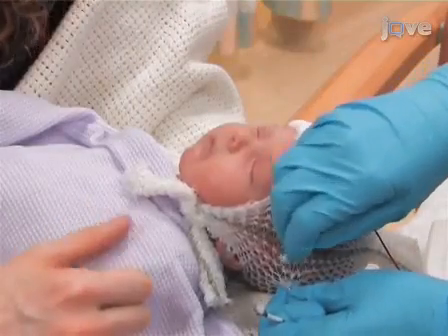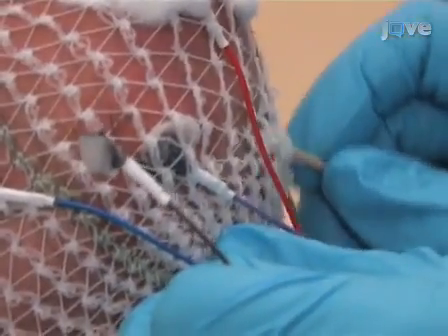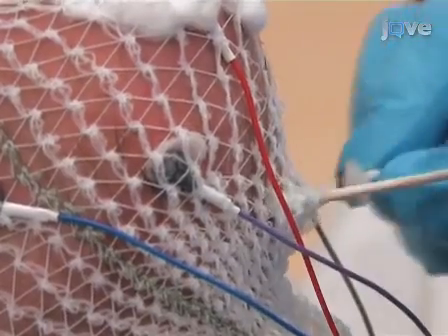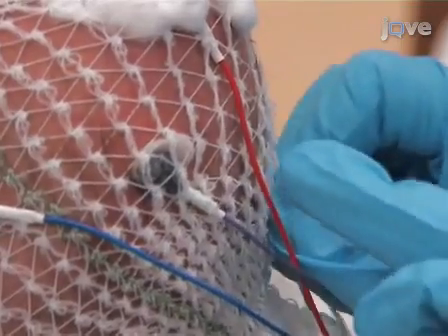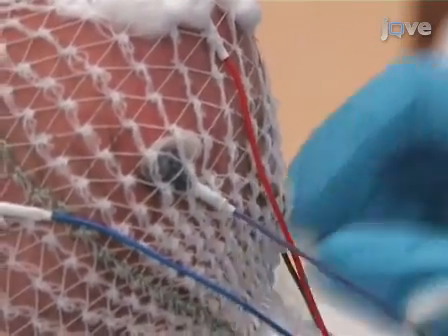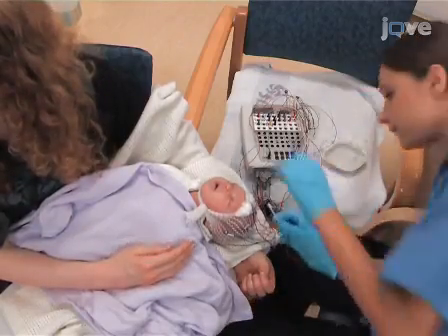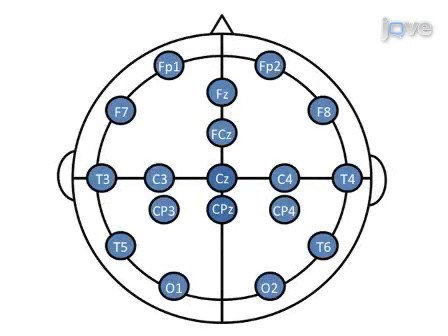To begin setup for this experiment, first prep the infant's skin, and then place a minimum of 16 individual disposable EEG silver chloride cup electrodes on the head according to the modified International 10-20 electrode placement system. Use EEG conductive paste to optimize electrode skin electric coupling. Here, a schematic of electrode placement for EEG recordings can be seen, modified from the International 10-20 electrode placement system.